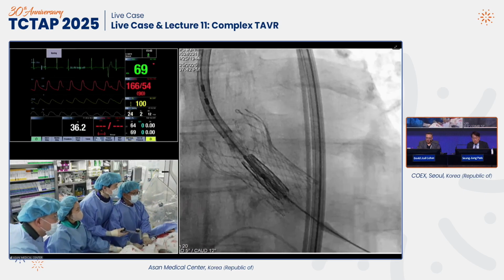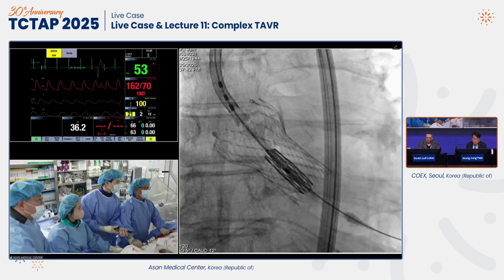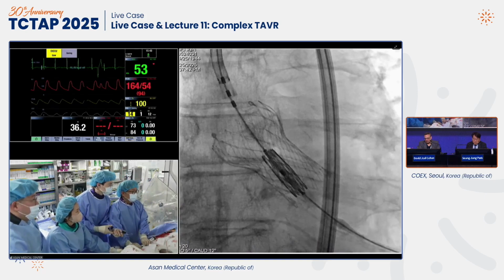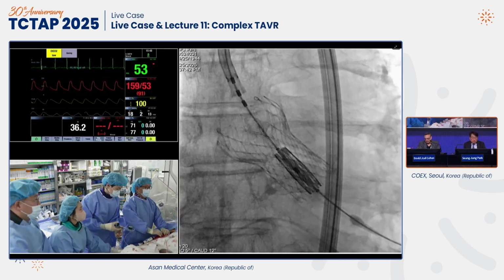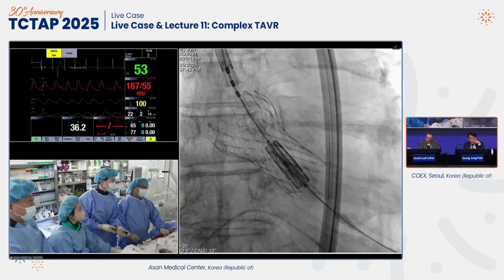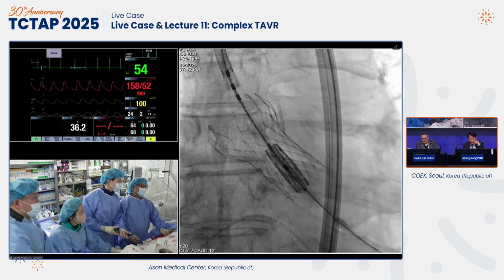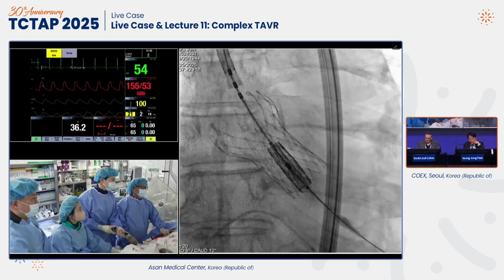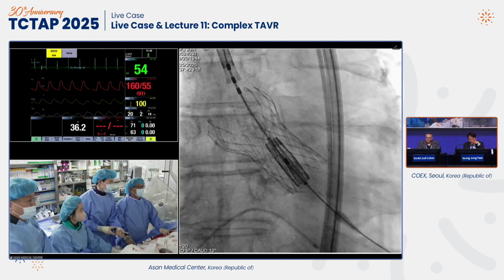And so how are you going to make sure you get this to the level you want? Are you going to put the top at node 6? Node 6. Actually, I'm very confused where is node 6, but I think around here it would be the very low node 6. Do you agree? Yeah, node 6. I think. Anyway, test please. I mean, if you get it at the bottom of the frame, it'll be at node 6.